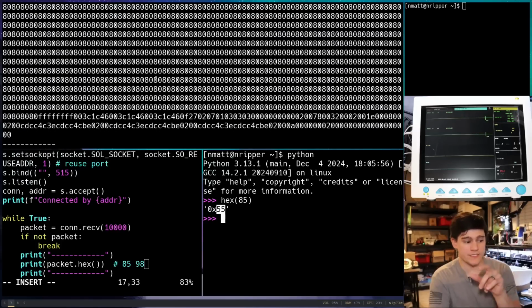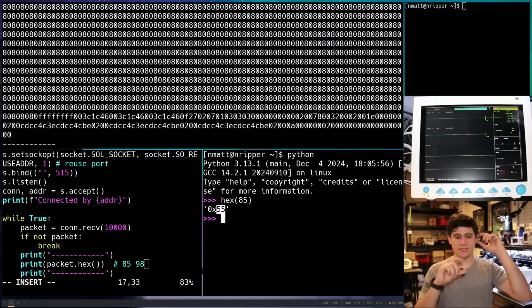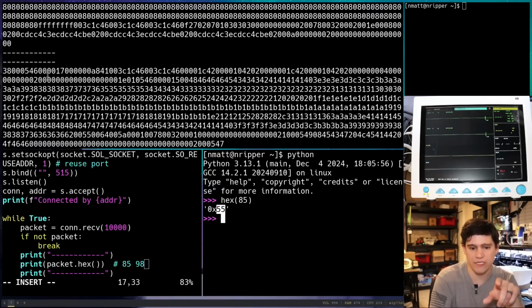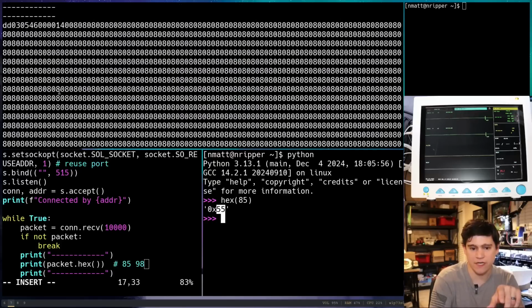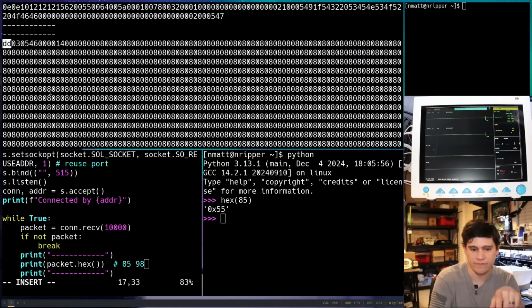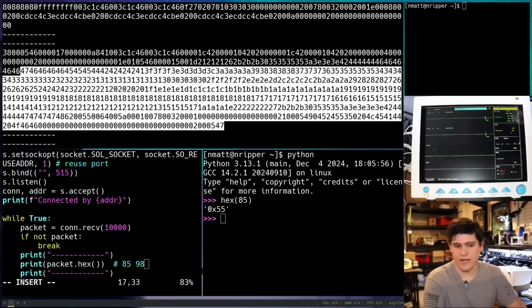So you'll notice that what we saw in Wireshark, and we're going to see here too, is that it's sending one packet and then another packet kind of really quickly. And that's happening every second or so. And so we can really easily start to see that some of these packets start with DD, and then other packets start with 38.